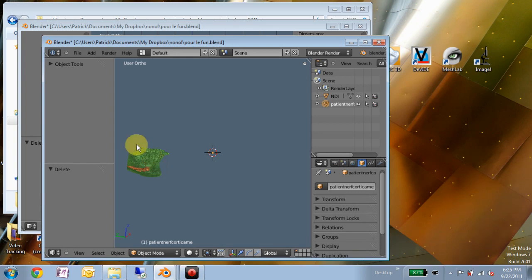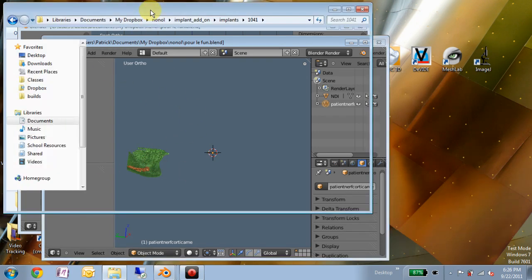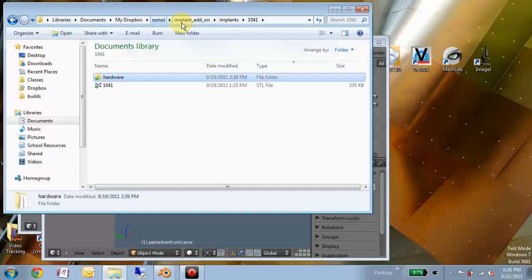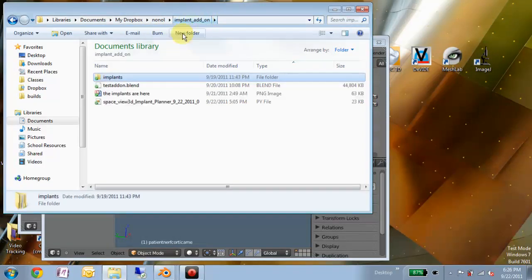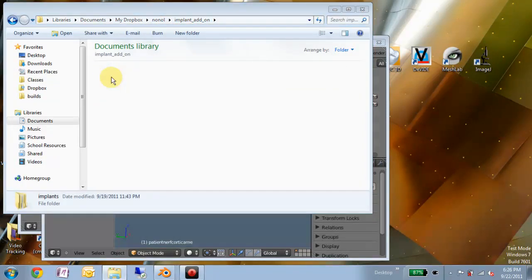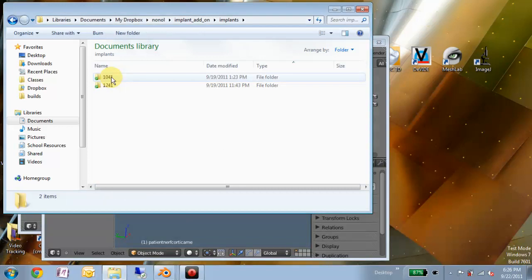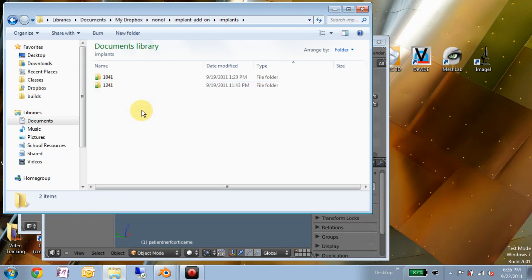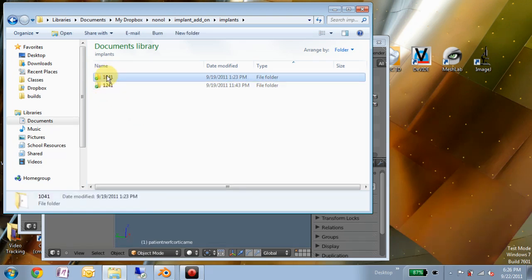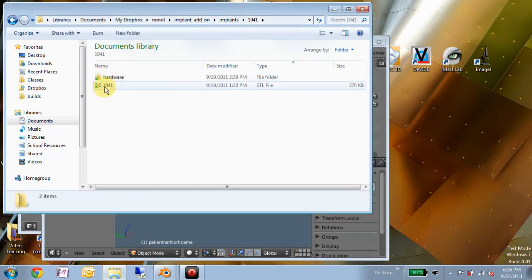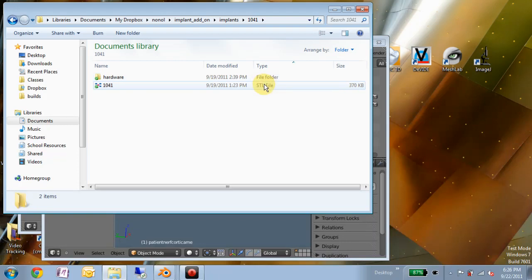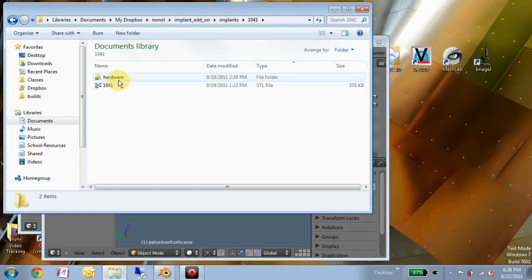Before we get into the actual add-on, I have as an example this folder called implants. This would represent a generic implant library, where each implant that you might work with would have its own folder. Within that folder is a 3D model, whether it be STL or obj or any other standard 3D mesh format representing the implant itself.